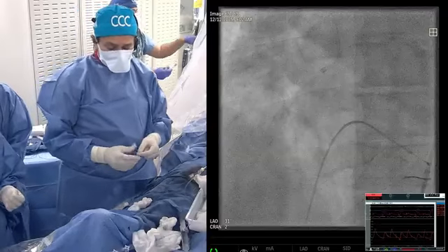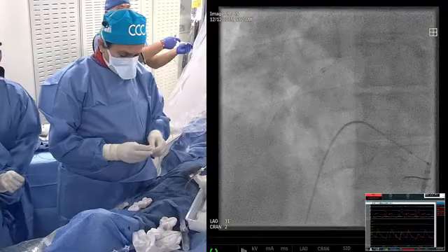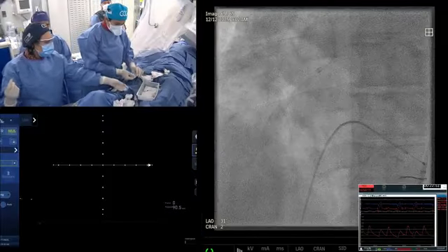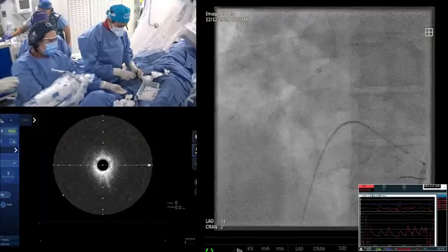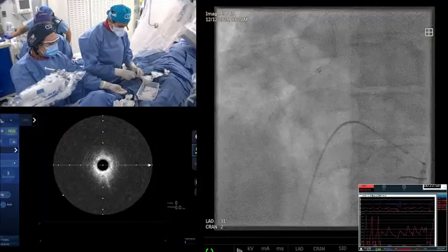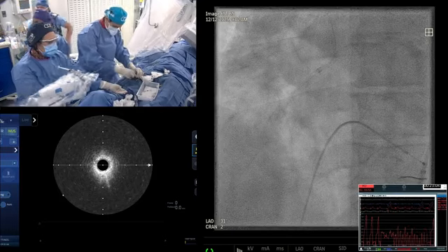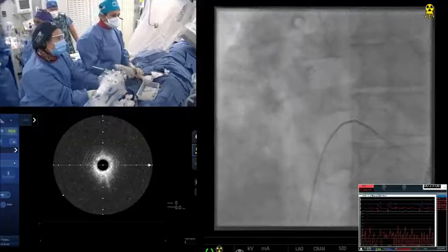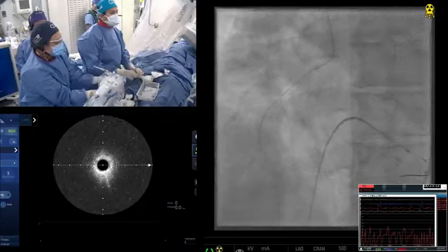I'll just do the mid. Okay, IVUS, Kiski. Yeah, sounds good. This patient has a very high pro-BNP, 40-plus thousand, although not in clear heart failure. Elective case, but still 40,000. Renal patients commonly have that. High CRP, renal failure. 3020 for the distal, yeah.